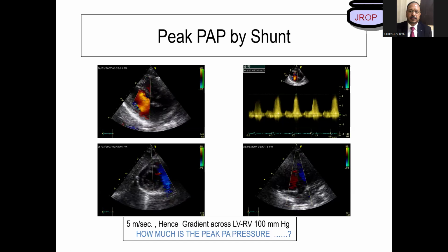Oh, 0.6 into 0.5, pulmonary. 56 into 0.6 add 2.1. So take a calculator. Dr. Vandana, do you calculate, count your money, or does your husband count your money? Your husband, yes. 35.7. So it is moderate pulmonary artery hypertension. Are we clear or not? Yes, sir. This time is clear.